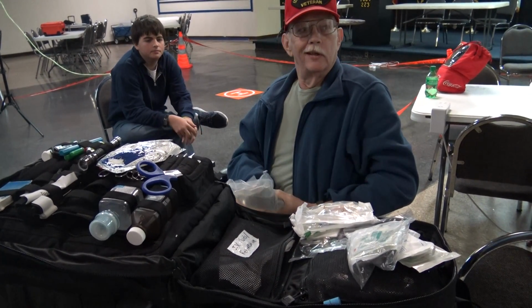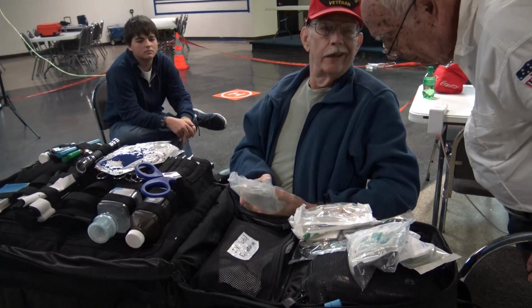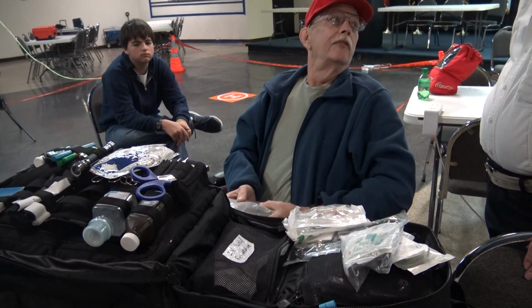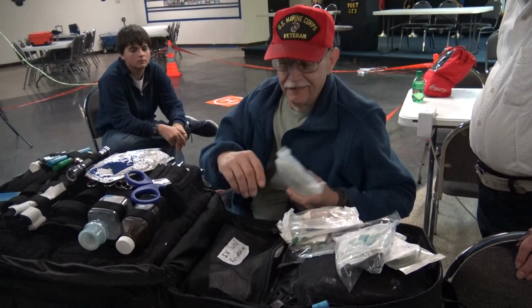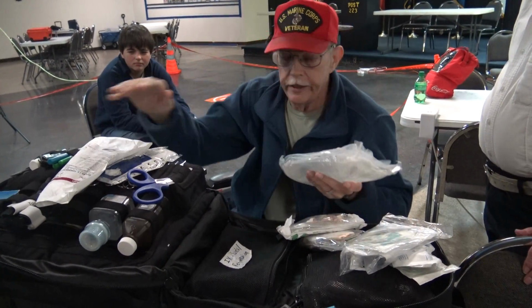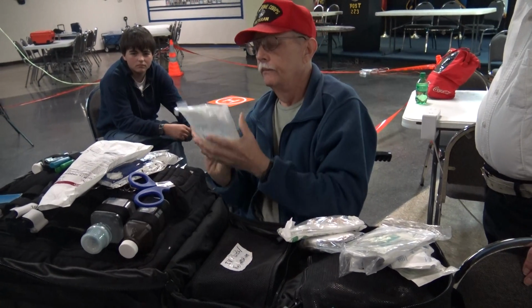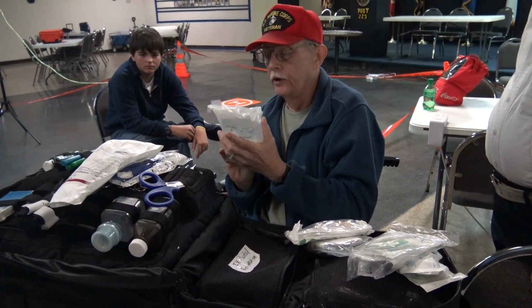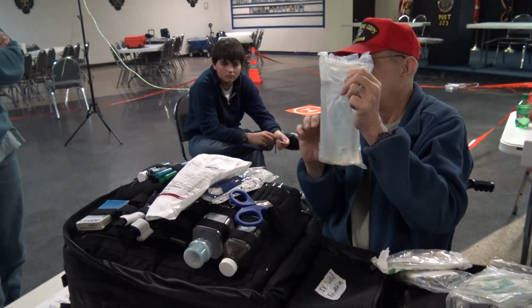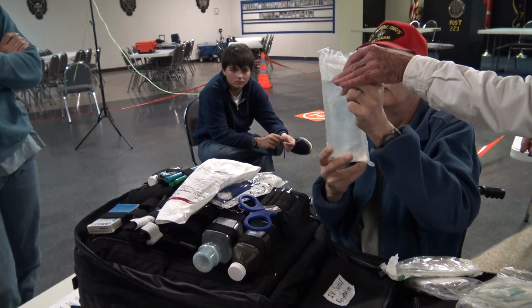I'm thinking about taking this 1,000 out and putting 2 500s in. It makes it less bulky. But you have to keep an eye on these too. They mark them as good for a year, but what you're looking for is floaters, the little white things that float around inside.